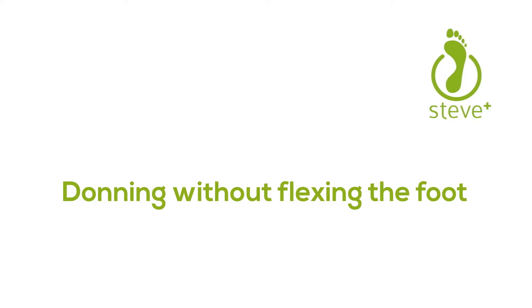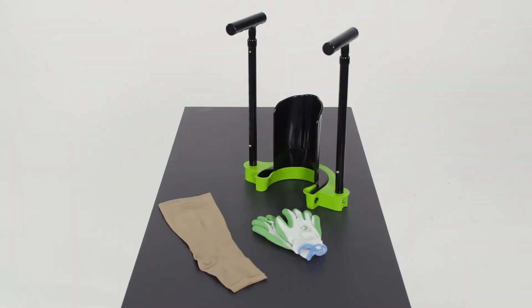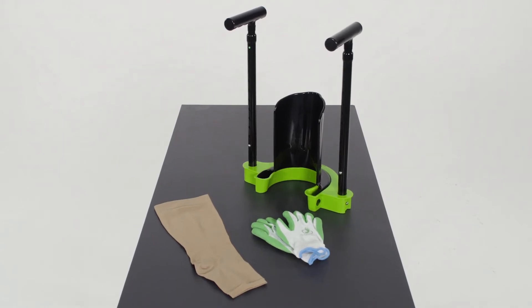Donning the Stocking. Place the Steve Plus in front of you, preferably on a table.